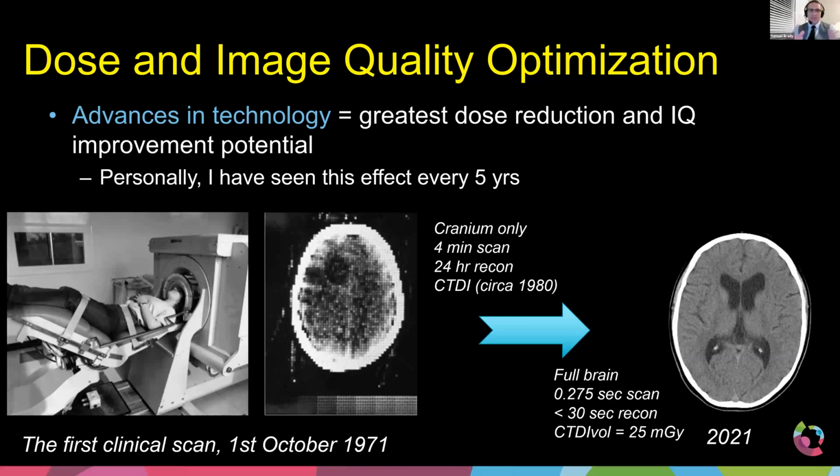All right, so, excuse me. We talked about image quality, we talked about how when new technology comes out, we should constantly be reassessing for image correcting for and using that new technology for improving image quality and potentially reducing radiation dose where possible. And I demonstrated that over the last 10 years, we in the US have been acquiring more CT scans in our medical population than we did a decade before. And we've been doing it at lower doses. And it's all because of, and I think it all just encapsulates it in this one slide here.